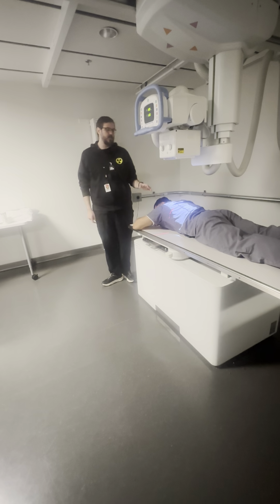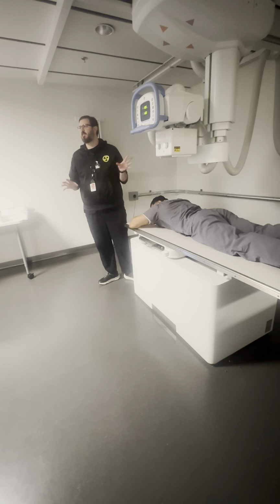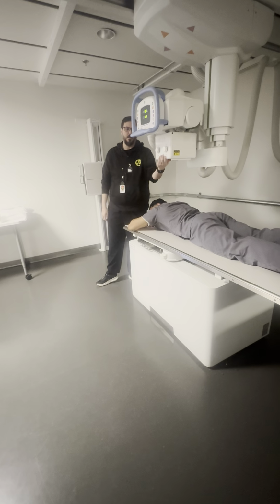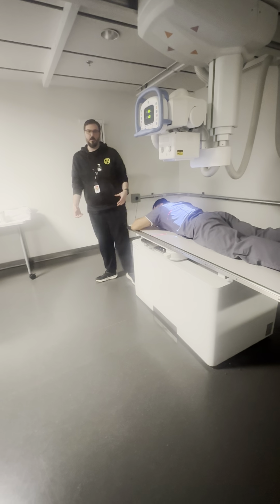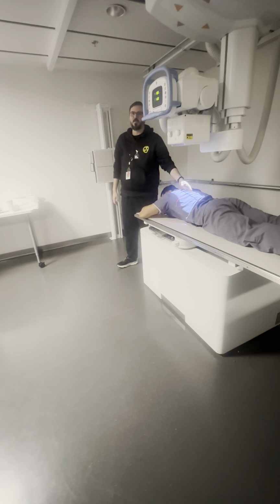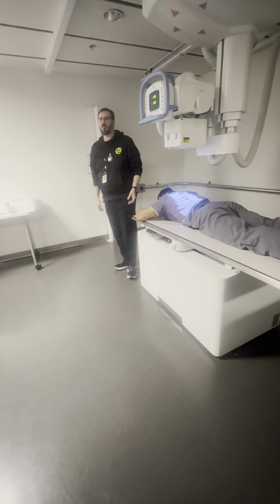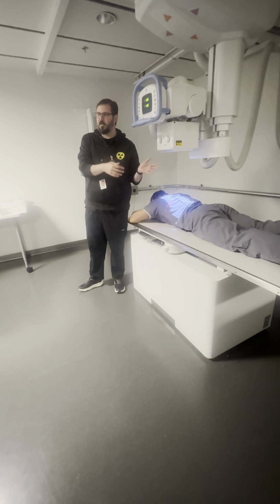The other thing to consider is body habitus. For the comp, we're just going to assume everyone's sthenic, meaning normal, just because it makes it easier for us to grade you. But if I have a patient who's hypersthenic, meaning really big, that stomach is going to come high and turn more this way. By going all the way to the spine, their stomach's not pushing completely to the right side, unless they have situs inversus. So it gets you a little leeway to deal with their body habitus as well.